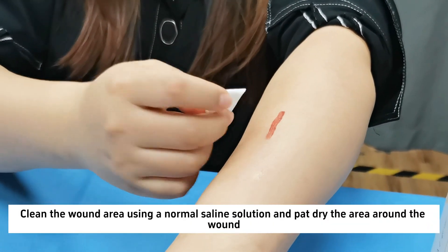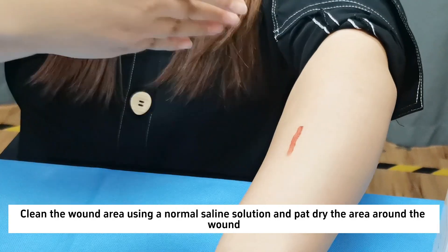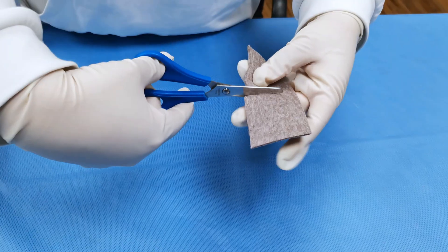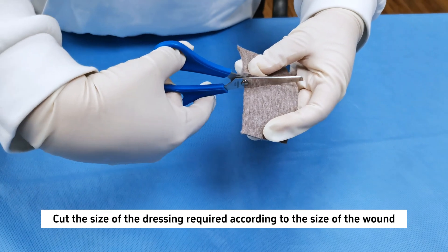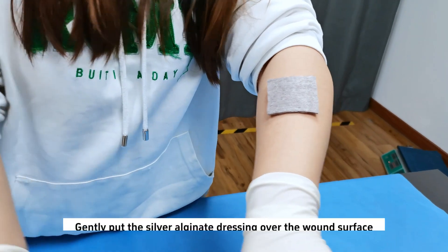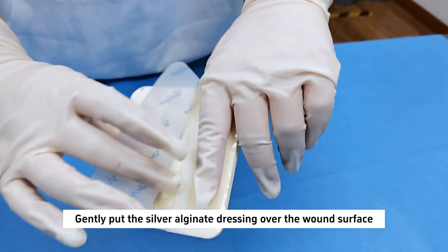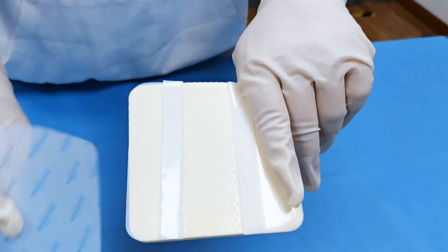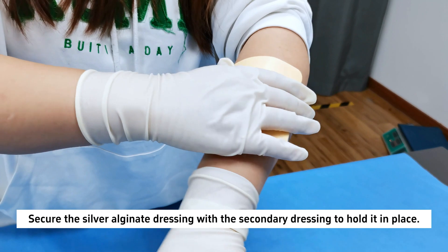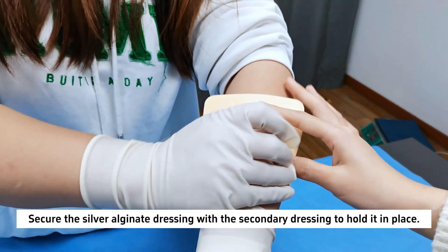Clean the wound area using a normal saline solution and pat dry the area around the wound. Cut the size of the dressing required according to the size of the wound. Gently put the silver alginate dressing over the wound surface. Secure the silver alginate dressing with the secondary dressing to hold it in place.